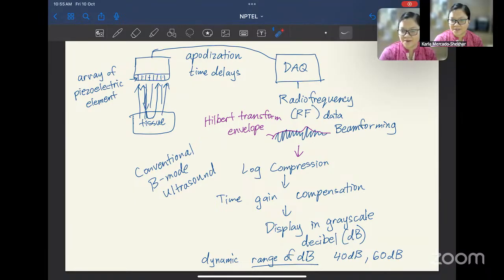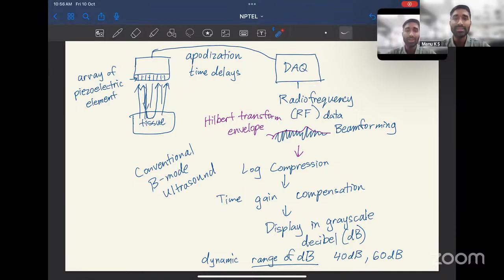Just because, in the ultrasound megahertz range, you're talking about microsecond waves, which means that the delays you put in will be on the order of microseconds. To implement that in hardware, you really need fine precision and smoothness of whatever lens you have to be able to dial in a specific time delay. I've never heard of it being used in commercial systems at present. Also, I think it's a lot easier to control the electronic time delay given to individual elements than to do that part in hardware.